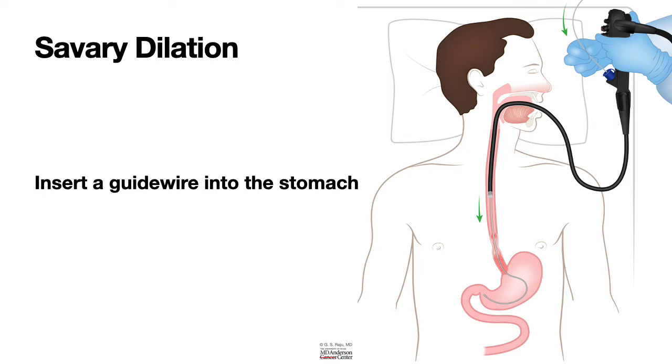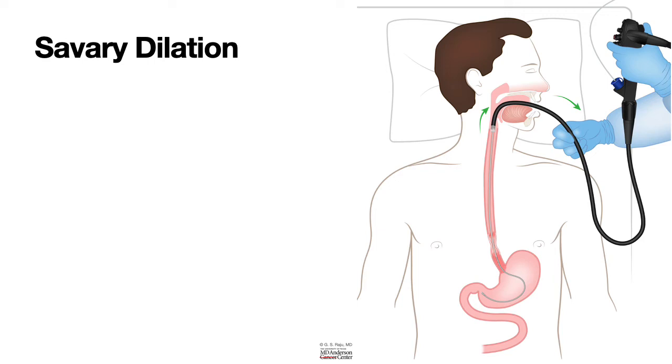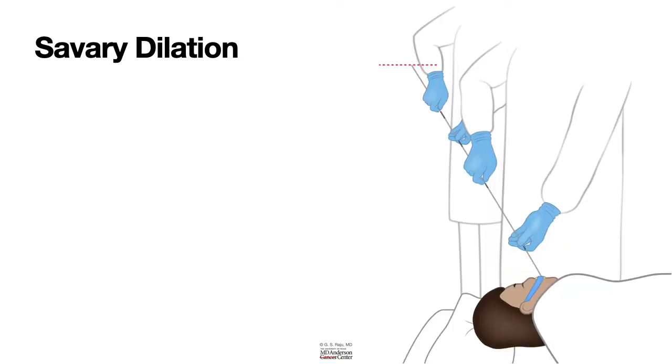Once the guide wire is inserted in the stomach, you gently remove the endoscope while keeping the guide wire in place. That is done by the endoscopist. So you remove the endoscope, keeping the guide wire in place, either by checking the fluoroscopy or, for an experienced endoscopist, as he pulls the scope out, he moves the guide wire in about the same amount of distance so that the guide wire does not slip out. So once the guide wire is in the antrum and has gone through the stricture down the stomach into the antrum, you start the Savary dilation.